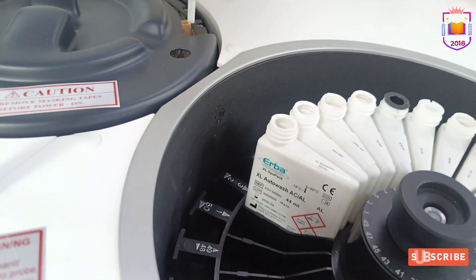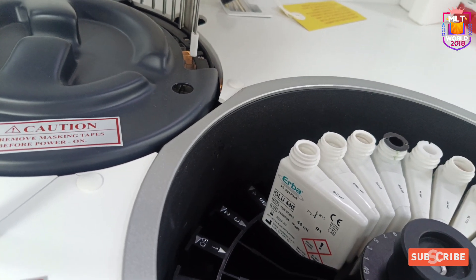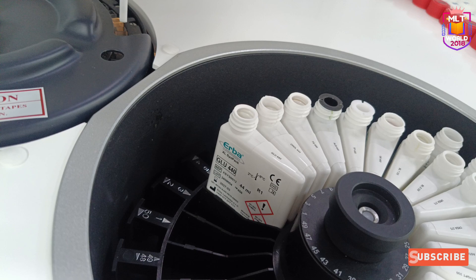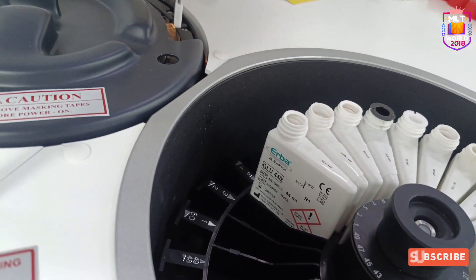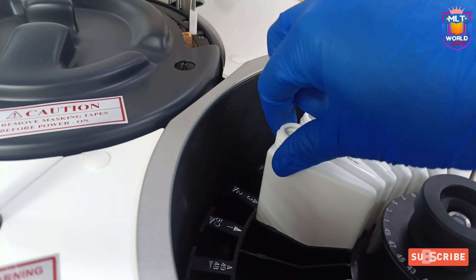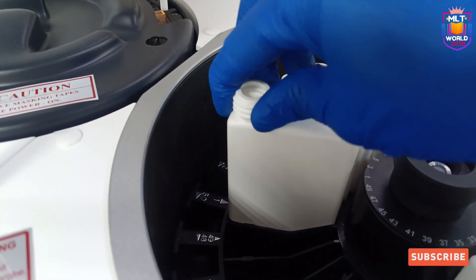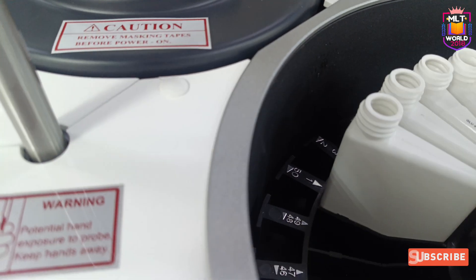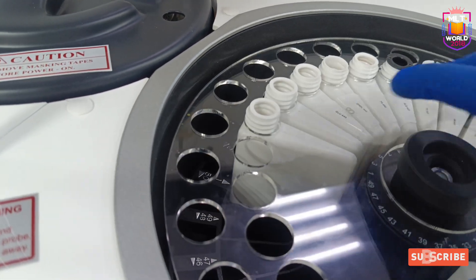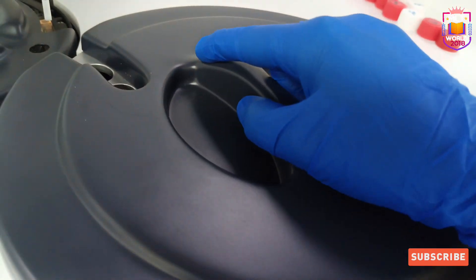In this video I have shown the step-by-step complete auto wash procedure in the Arba XL 200 Analyzer. If you have any doubts related to this auto wash maintenance, please write in the comments. If you like this video, press the like button, and if any colleagues use this machine, please share this video — it will be helpful for everyone. In the comments please mention any topic you want to learn, and I will meet you with a new video as soon as possible. Thank you so much.